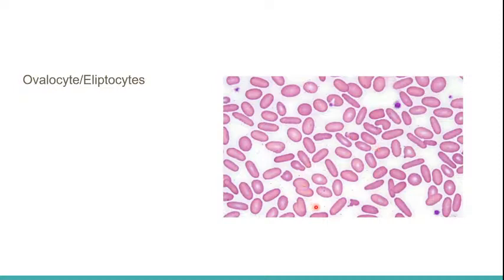Surprisingly enough, we have one patient who has this kind of condition, which is hereditary elliptocytosis. Unfortunately, his elliptocytosis was not detected until the physicians found it strange that there's always a flag in the machine, but the results are always normal.